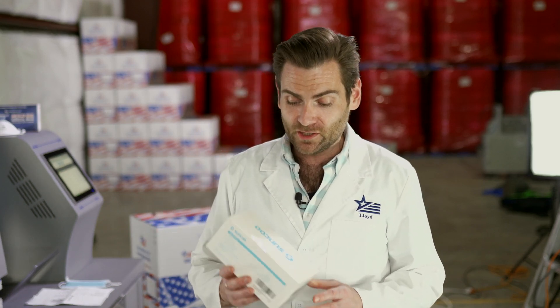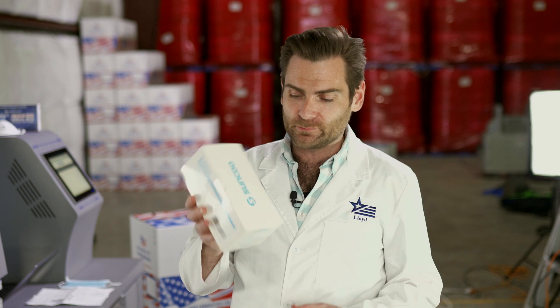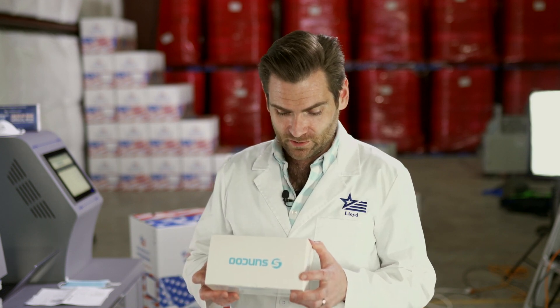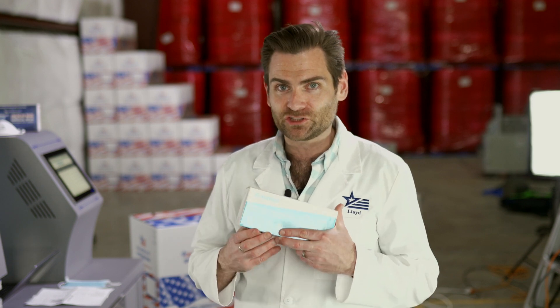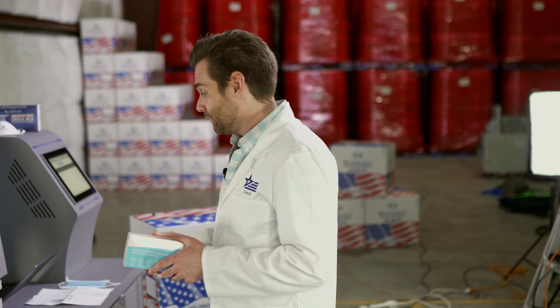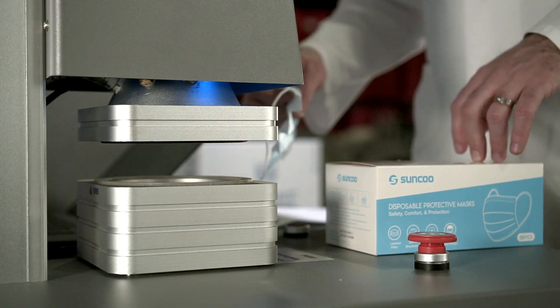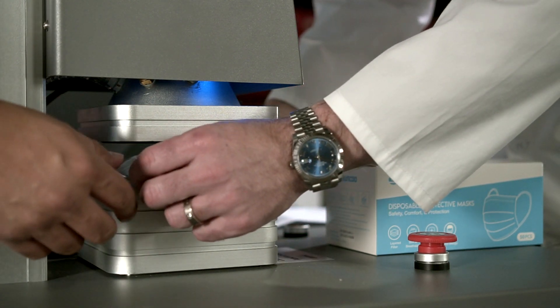We're testing every mask on Amazon. Today we're looking at the Sunku mask — disposable protective masks claiming safety, comfort, and protection. It's got a shield with a cross on it, and they claim to 'protect every breath.' Let's find out if it does. Speaking of claims, do we have any efficiency claims on this?